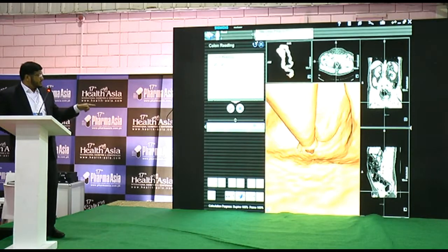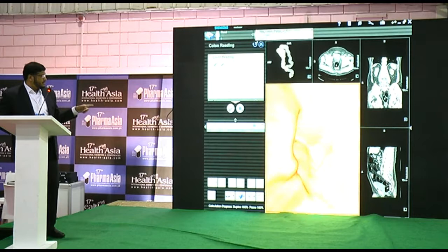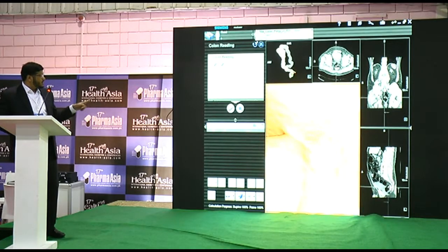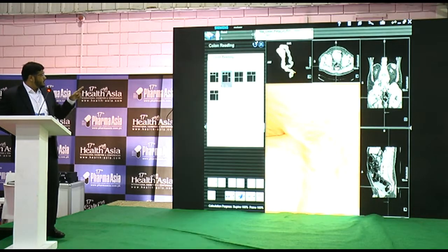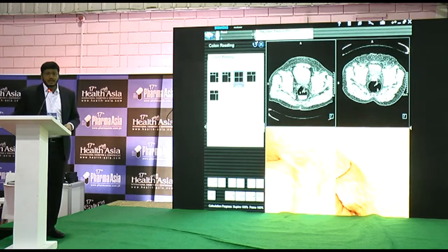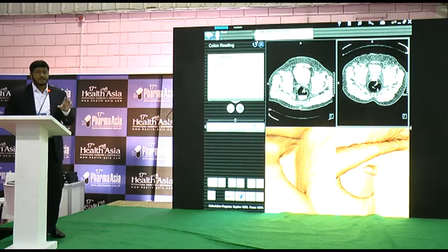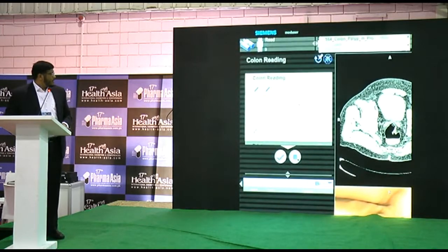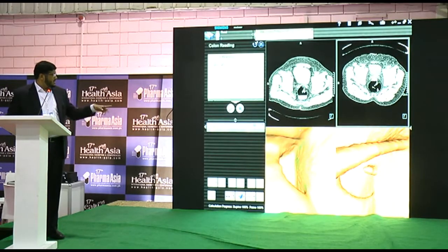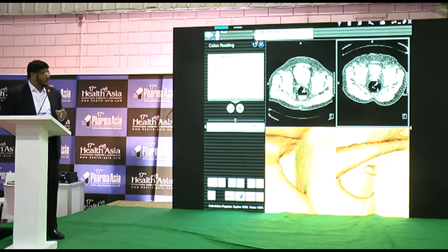So the virtual endoscope is already placed within the rectal lumen, and we can fly through easily. But before the fly through, we usually set our system into supine and prone positions in order to better depict and not miss a lesion, which can be hidden inside the fluid, as we can see here. There are also options of stool tagging, in which these green areas are stool, so a small polyp may not be missed.